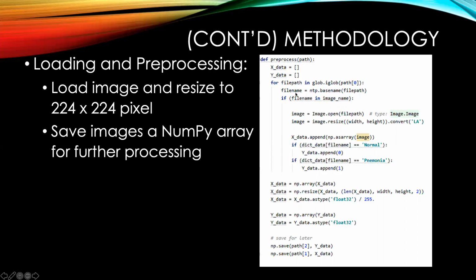One will realize that with this if conditional loop, what I did was to build some sort of a dictionary using the CSV file that was provided with the data. And at the end, I'll put a link there for you to check it out.